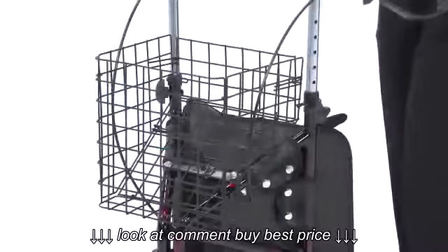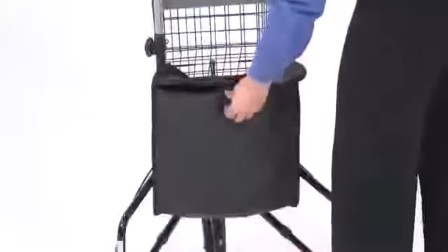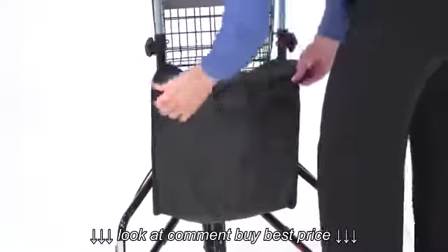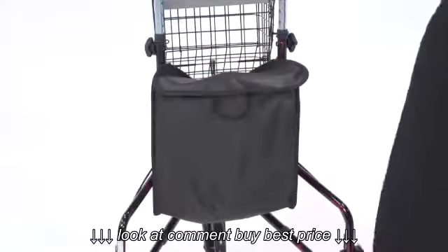The rollator also comes equipped with a basket, a tray, and a private pouch, which are conveniently removable and easy to clean. It's a perfect way to secure items while you're out and about.